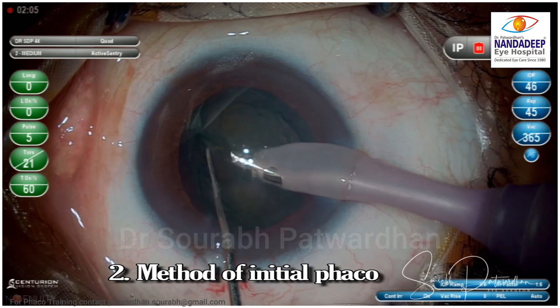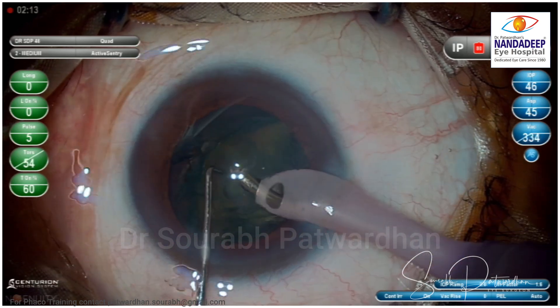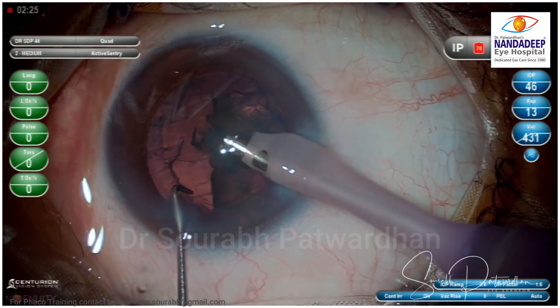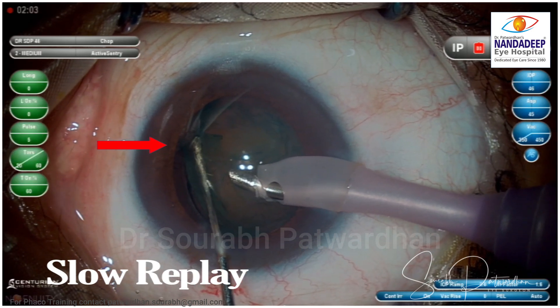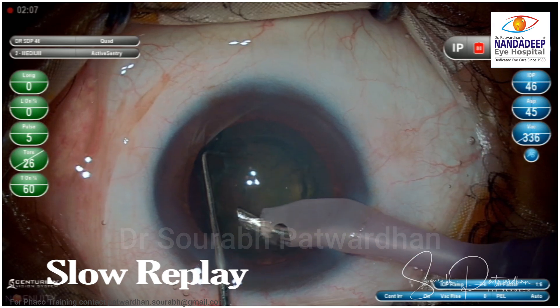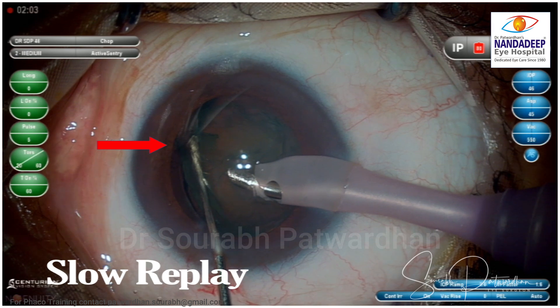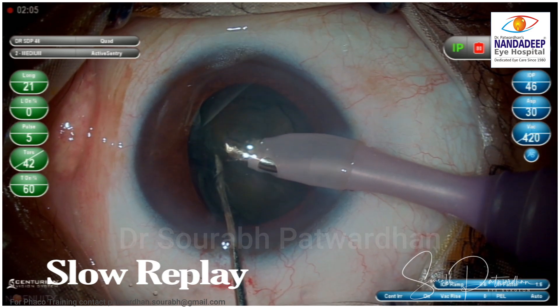Second is the method of initial feco. Previously I used to try to start aspirating in one go, but here what I am doing differently is keeping my second instrument behind the nucleus. When I keep it behind the pole which has prolapsed out, it acts as a barrier between the posterior capsule and my feco tip. The idea is to emulsify all the nucleus part which is between the Sinski instrument and the feco tip — essentially shaving off the peripheral part of the nucleus. You can also use an iris repositor or lens spatula just behind the nucleus at the edge, and then emulsify the nucleus part between these two instruments. The second instrument has to be blunt so you can go behind the prolapsed part easily.